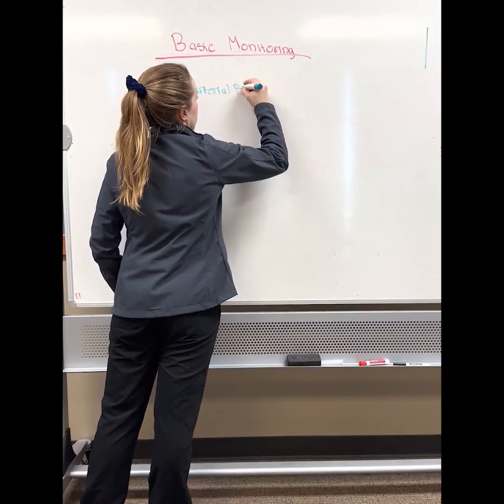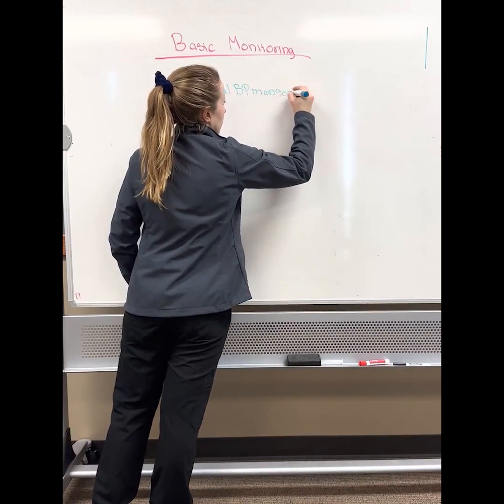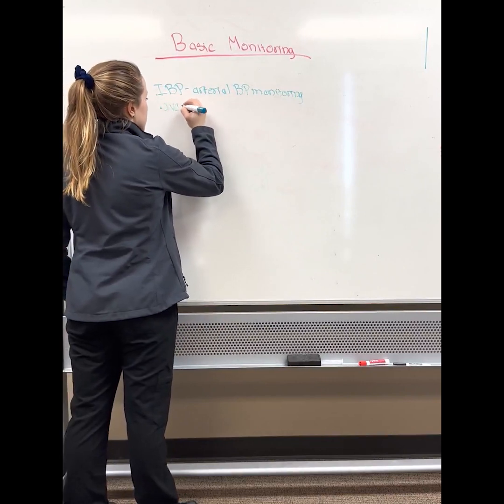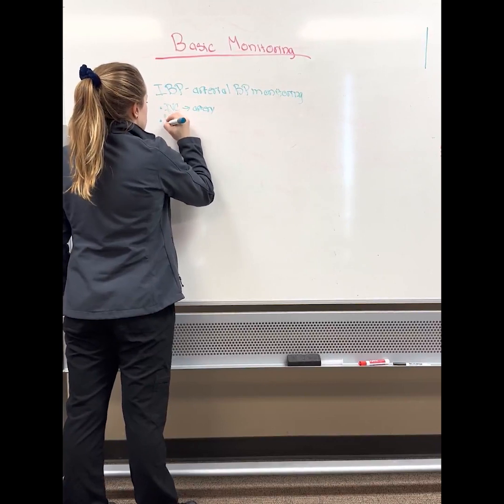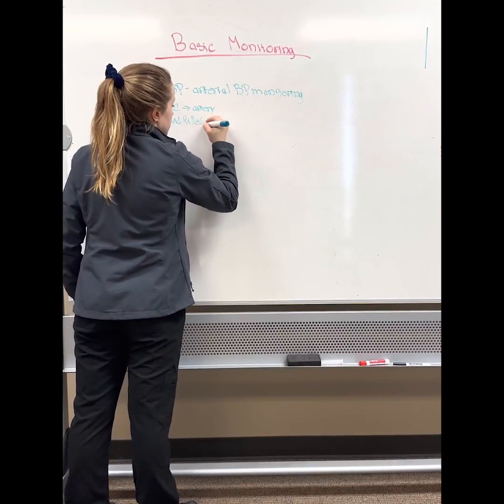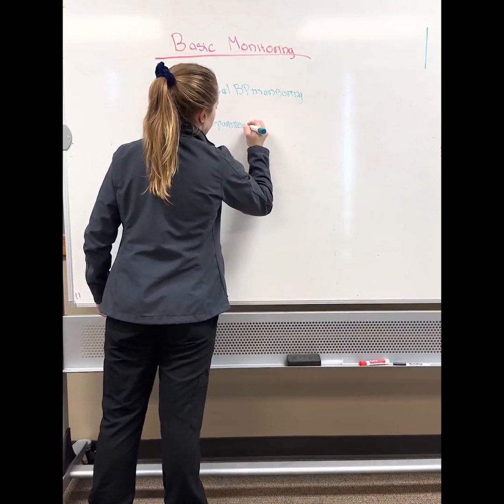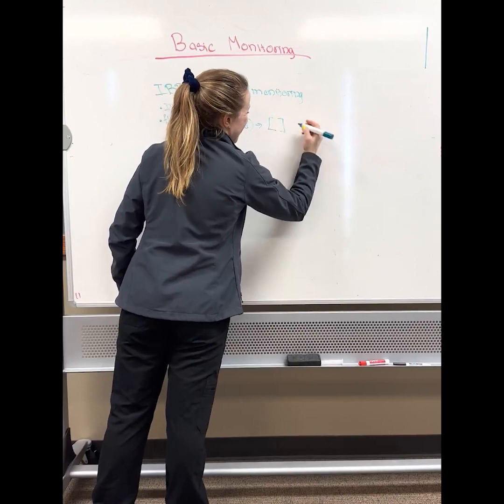Non-invasive works with a cuff or with a Doppler. But with invasive blood pressure, an IV catheter is going to go into an artery, and it's going to be attached to fluid-filled, heparinized tubing with a pressure bag.